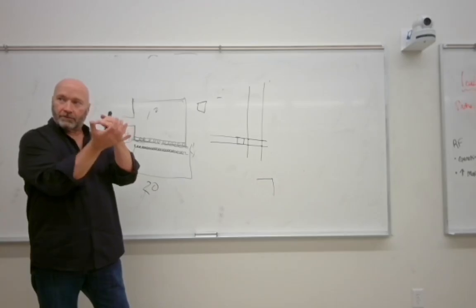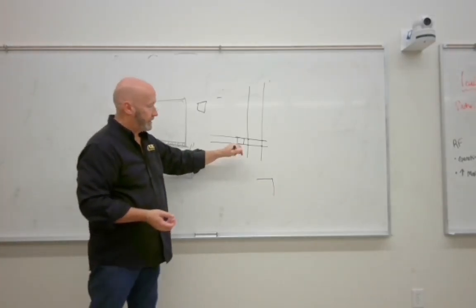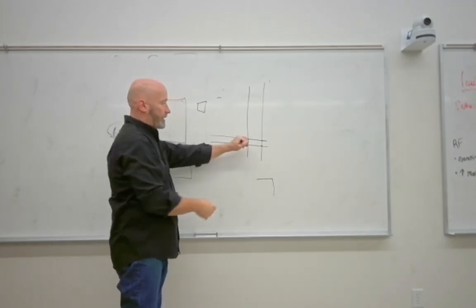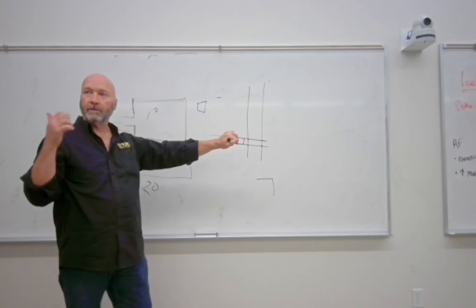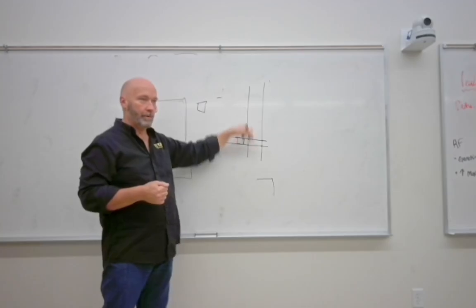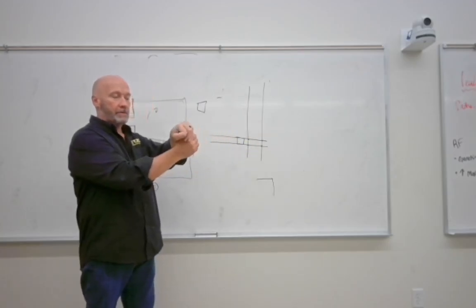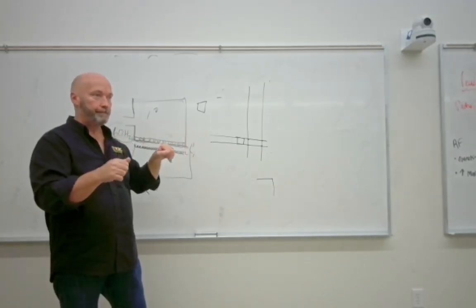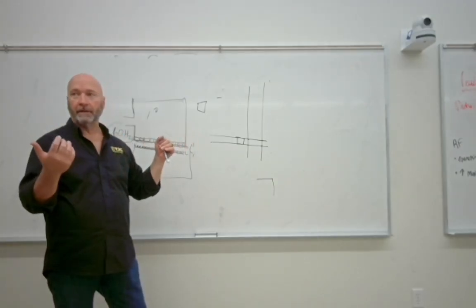You've got this strong set of brakes, springs pushing up into this set of rails to hold them in place. When you hit the button to move your control tower so that you can drag your tube across the room, it draws those back and releases the brakes so you can move it. And it's just a solenoid.